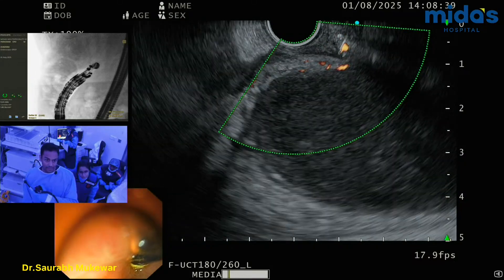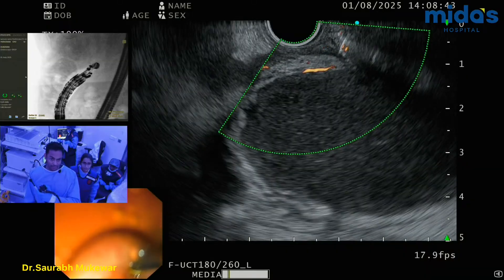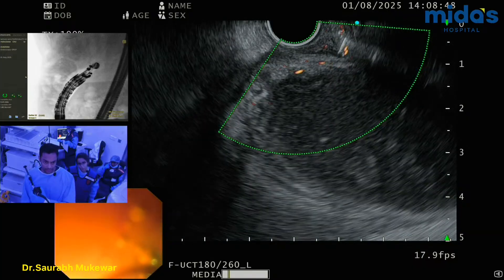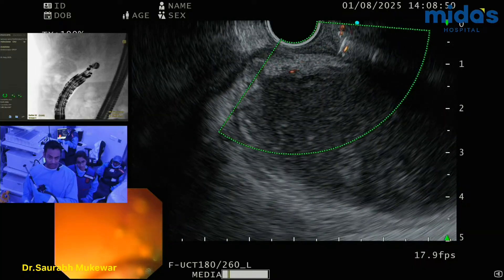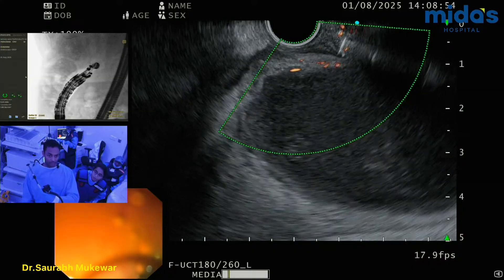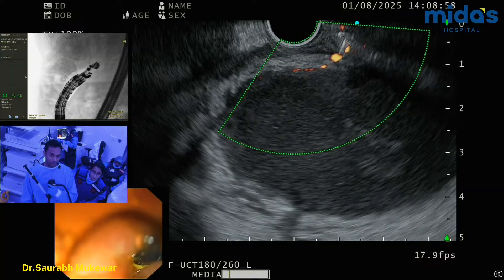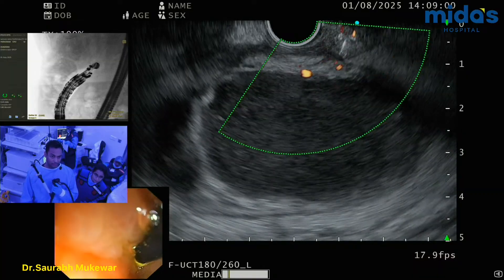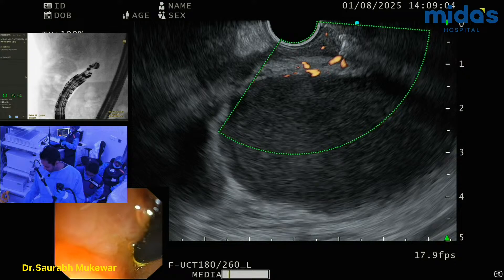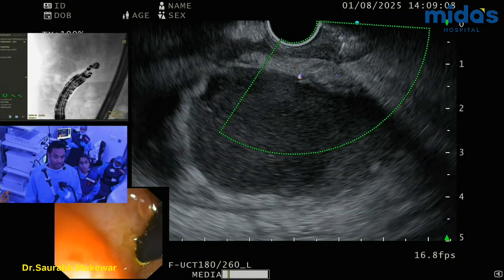Maybe somewhere there. You see, maybe somewhere there. That little bit of vessel, we can live with that much. Because anyways, the stent is going to cause some tamponade effect. And I think this is — see, it's not a great position, but this is probably my only best bet. Because the moment I turn counter-clockwise, I see these large vessels coming here. And more — it's pulsatile. I can't touch there.